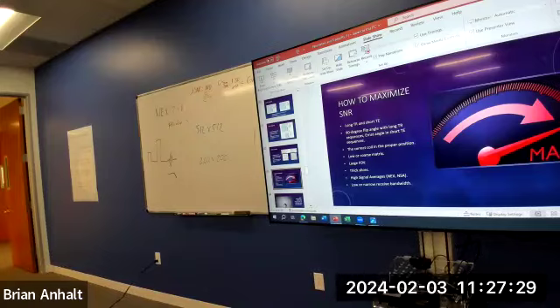You're expanding the frequency, but you're also increasing the signal. So a lower frequency is better. Yeah, lower frequency is better for the amount of signal. Okay, cool. If you have more noise, that's why you want less bandwidth, right?